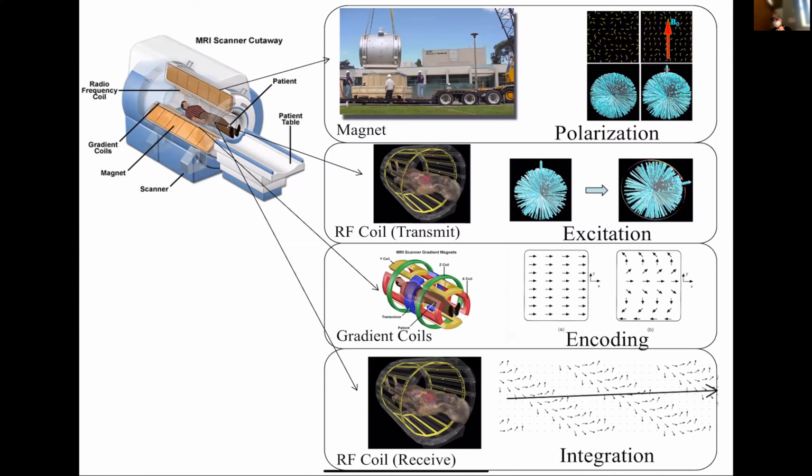And so in general, you see the RF coil is used twice. It's used for transmit and receive. You could use the same coil for both. You could transmit with a lot of high power, and then you would switch into the receive network, and that same coil could be used to receive the signal. That is sometimes used, but what's more commonly used these days is you'll transmit with one coil and then receive with an array of smaller coils. So you'll see coils that are both transmit and receive, but you also see a transmit coil that can just be used in transmit, and sometimes it's transmit only, and then you'll have receive only coils.